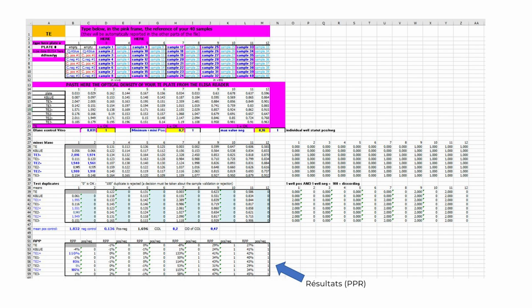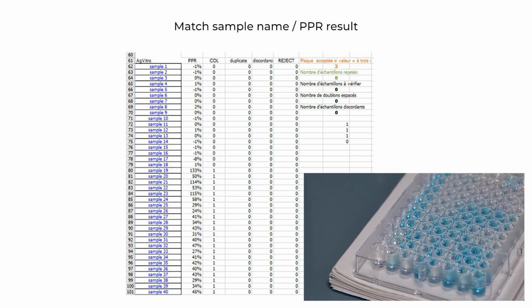Interpretation of the test, negative-positive, is shown in the column cut-off line COL. A sample is positive when its RPP is above the positivity threshold, and it is negative when the RPP is equal or below the positivity threshold.